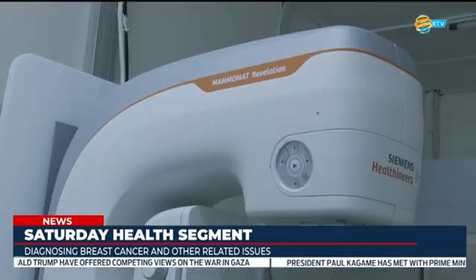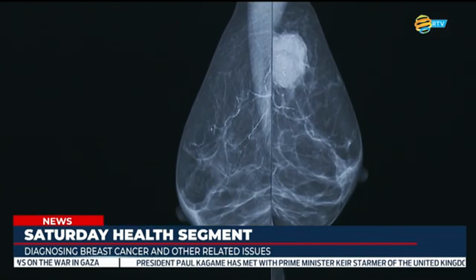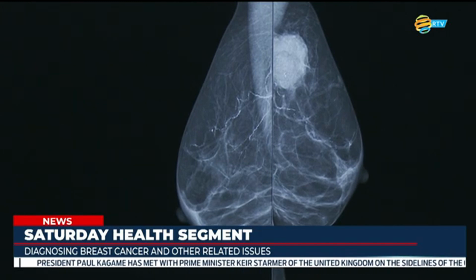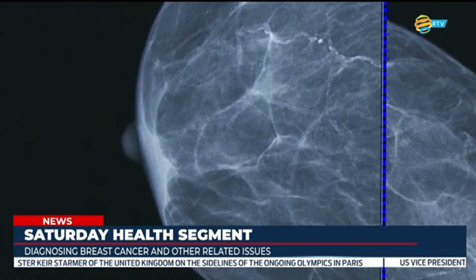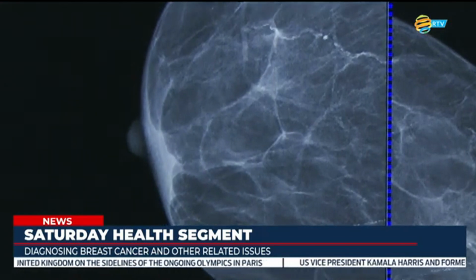So mainly, the main goal of this machine is to detect the cancer region versus non-cancer region, or to reassure the patient if there is no abnormal finding in her breast, regardless of the pain or the other symptoms that they present with. Like this machine, we can do what we call tomosynthesis.